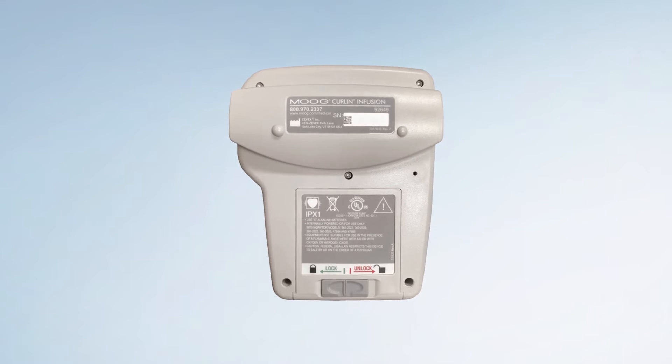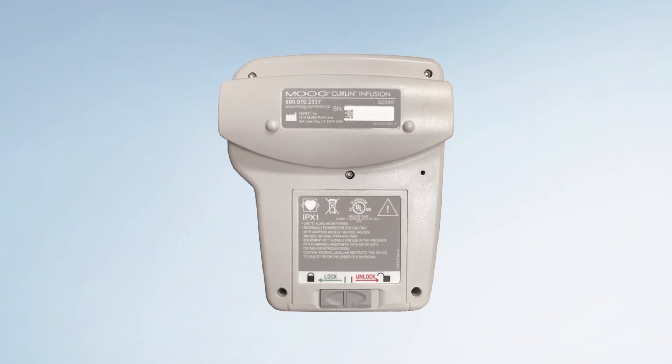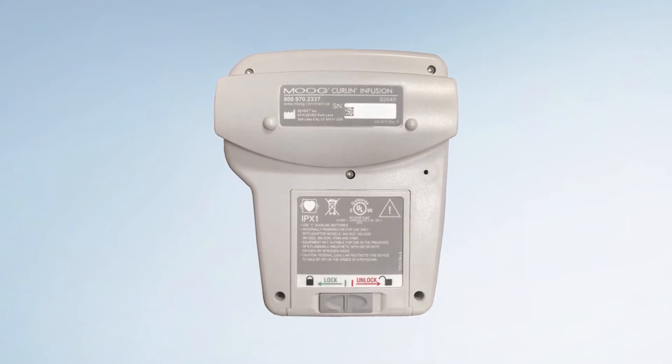Notice the pump is small, lightweight, and easy to carry. It weighs only 18.1 ounces, which includes the two C-cell batteries.